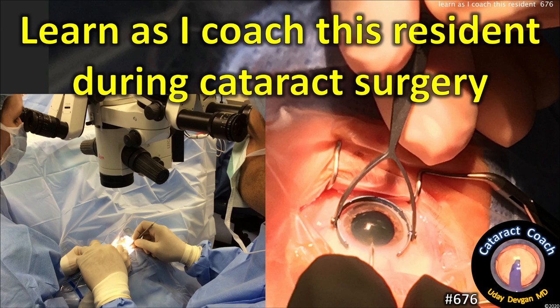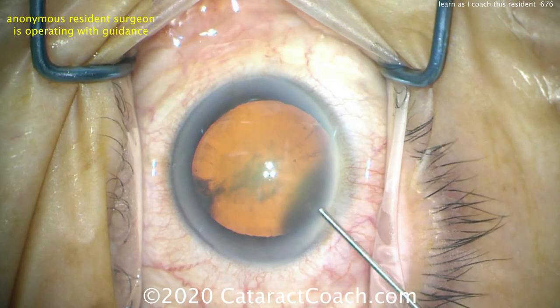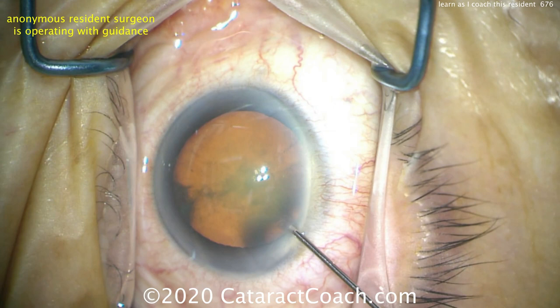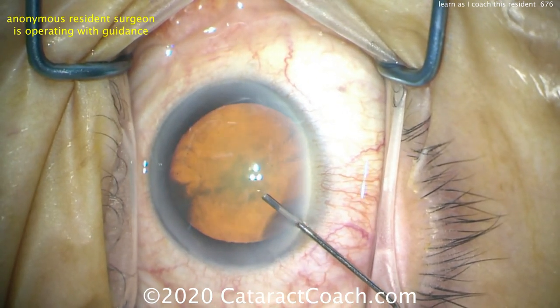CataractCoach.com. Learn as I coach this resident during cataract surgery. People ask me what it's like to be coached by you in the operating room — let me show you. This is a resident who's doing the surgery. I'm sitting on the sidelines just watching and coaching as she does the surgery.